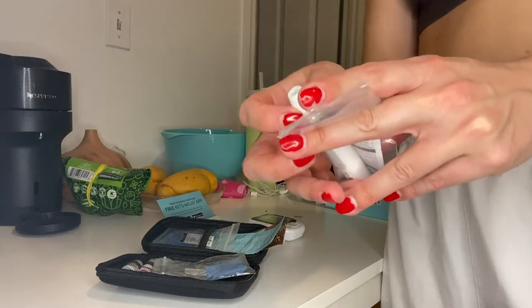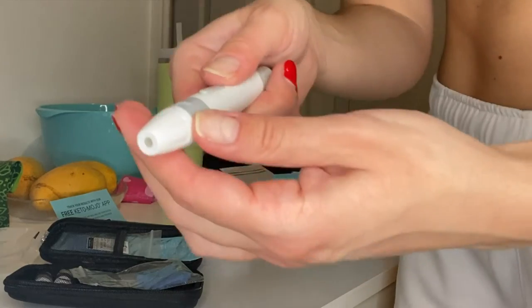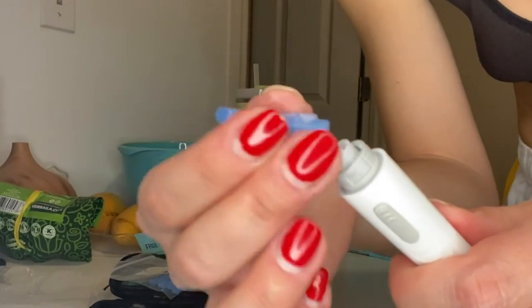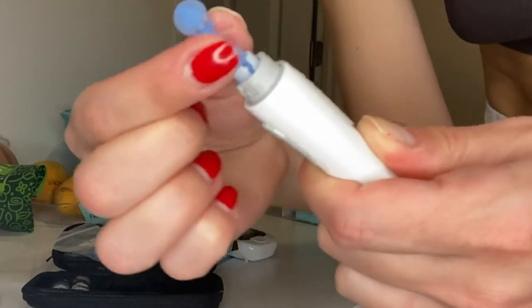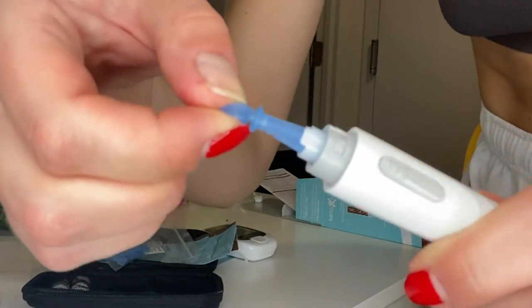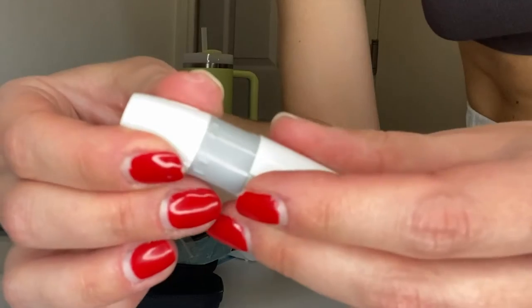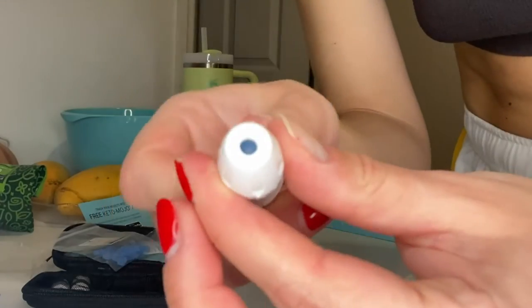I'm going to open this and insert the needle. This thing actually twists off and then you put the needle in here. This is the needle, and it says to just insert it firmly until you can't anymore — so you just push it in and then you break the cap off. There's the needle. We're just going to twist this back on.